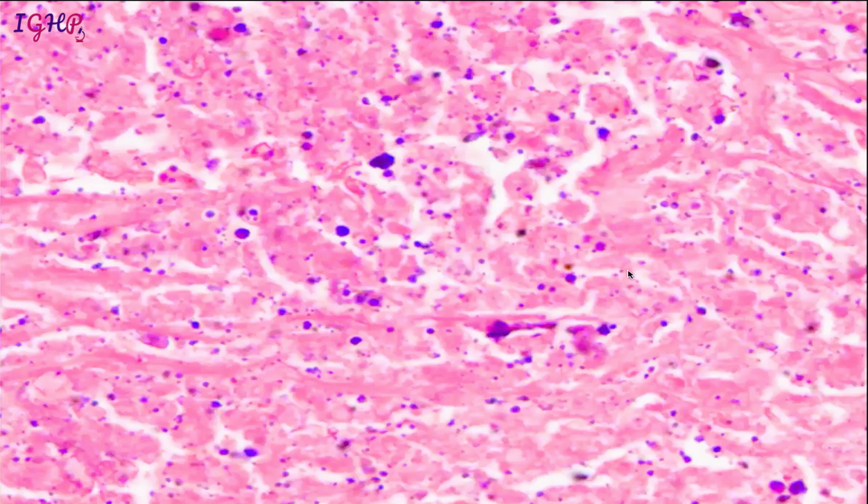Again, an area which is showing necrosis, and over the necrosis you are seeing these hematoxylin-like bodies. So sometimes you will say that the hematoxylin is not properly filtered, but actually these are not hematoxylin bodies. These are actually the debris, cellular debris, which are seen in addition to the necrotic material.